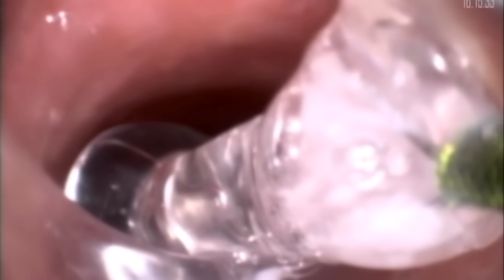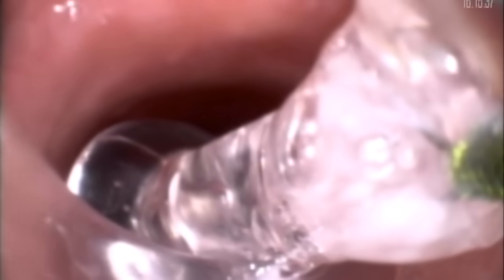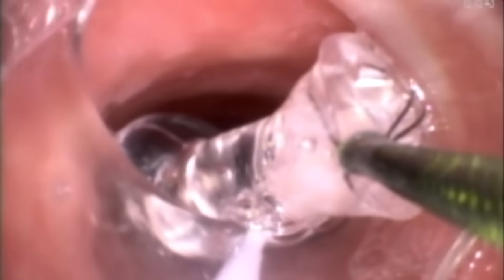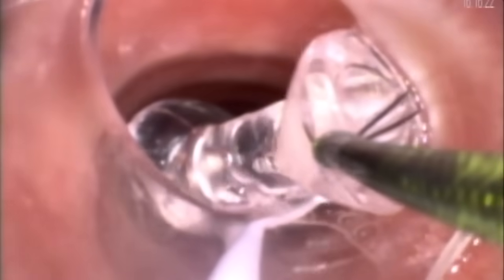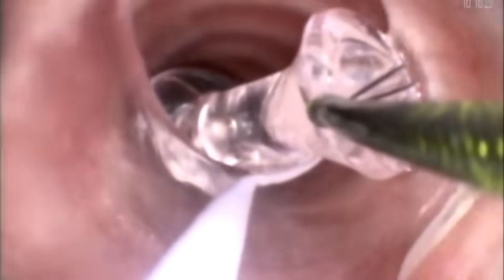The pushpin and the endotracheal tube will now need to be removed simultaneously. With everything ready, the pushpin and the endotracheal tube are now removed simultaneously. We had another endotracheal tube ready so the patient could be quickly re-intubated.